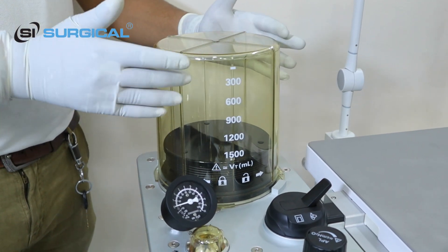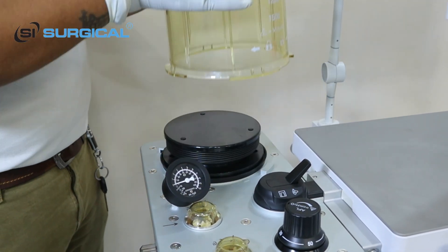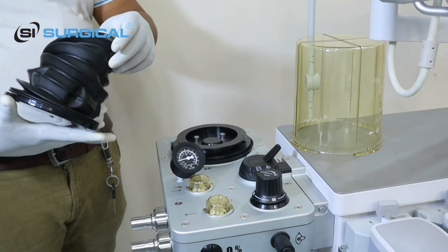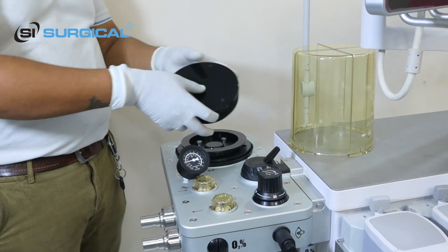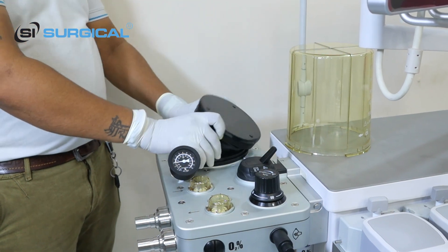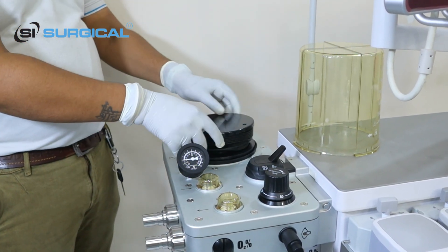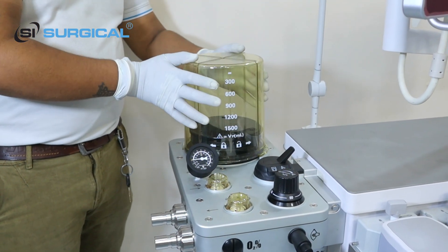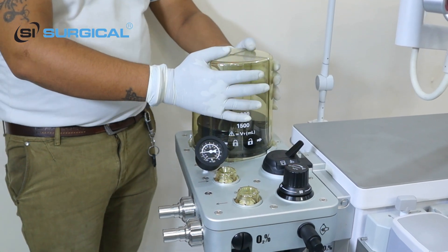This is the bellows. If you want to clean the bellows, you just rotate it and it will be opened — pull it up and the bellows is open. When you want to clean it, you pull the rubber piece, lock it, and rotate it to the left side — it becomes locked.